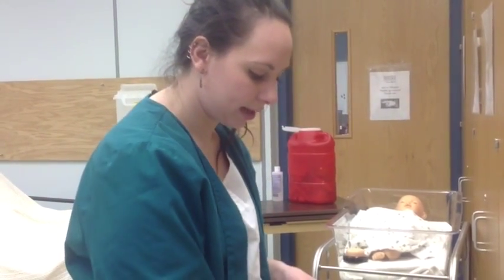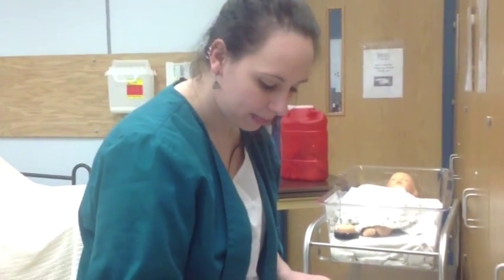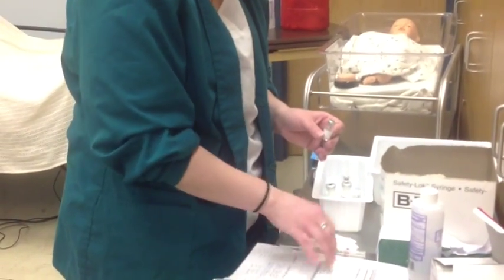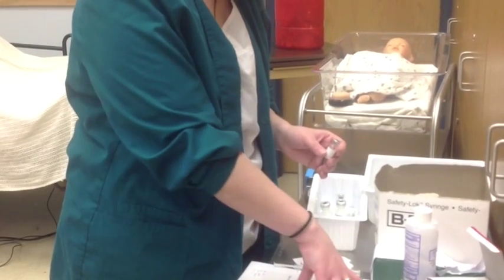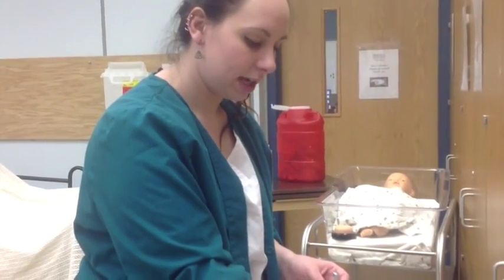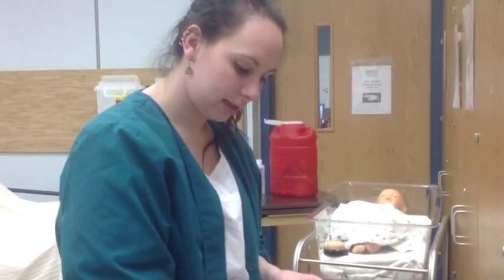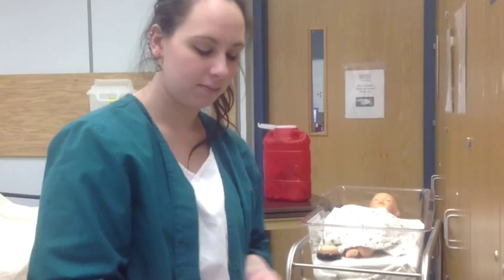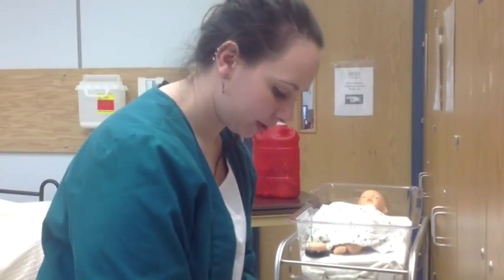So I'm going to have to put away my vial, but I want to just double check one last time that everything's correct. So I'm going to make sure I drew up the right amount, which is 0.5 ml. 0.5 ml is the right route. This is an IM medication. For the patient, baby Charles, for 11 a.m., which is the time, and then the date of birth, which is today's date, and then the hepatitis vaccine for the reason for getting vaccinated. So I'm going to put the medication away, and now I'm going to grab my supplies.